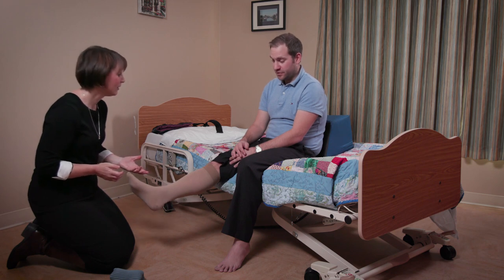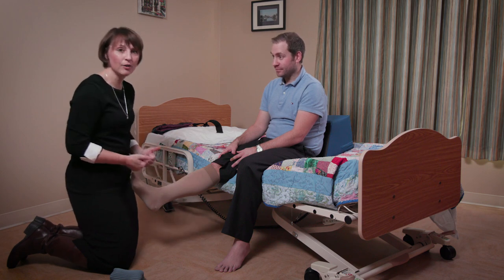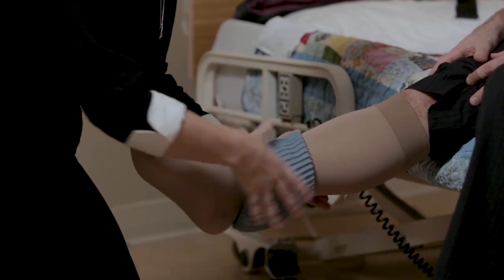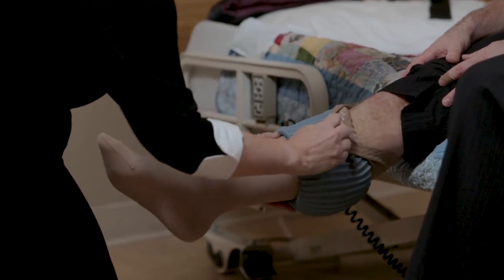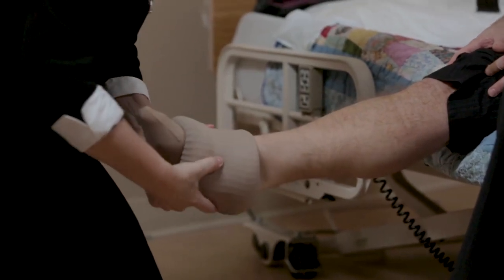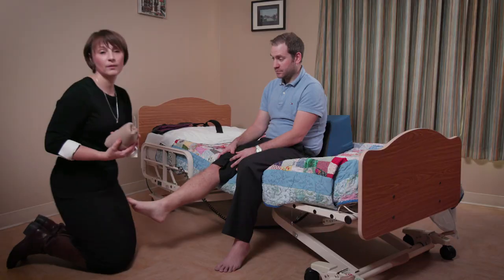Feel okay? Feels great. Now for taking off the compression stocking — the same process applies. We slip on the Dauphin Donner, flip back the cuff, and as we do that it rolls off — especially over that awkward part of the heel — and there we go.